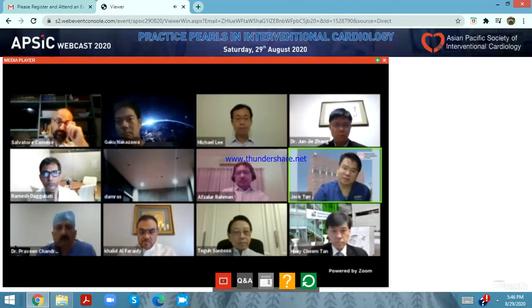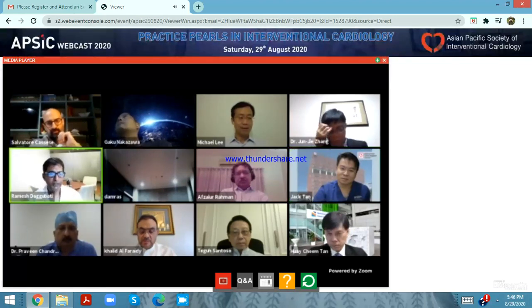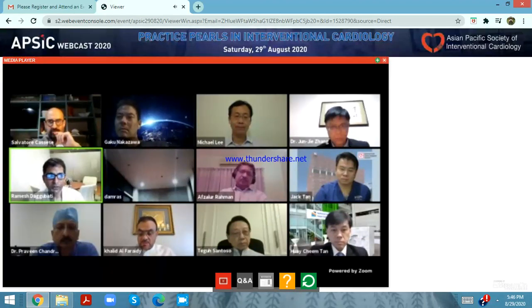Can I just pick the brain of Ramesh and Michael? The lithotripsy technology they are pitching to apply in the aortic valve as well. What are your thoughts on that? I think that'll be a great thing if you can make a large balloon, of size 20 or 25 and up to 26 millimeter, and deliver it at 4 atmospheres, the risk of a severe AI probably will be less.